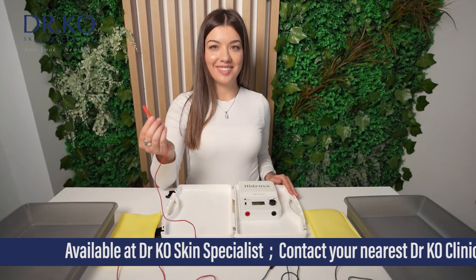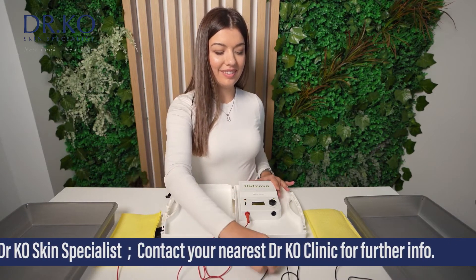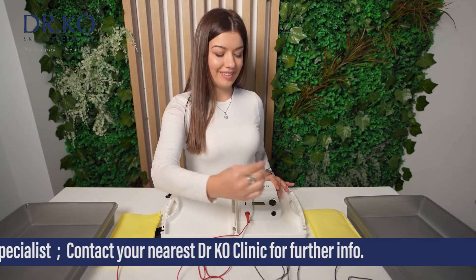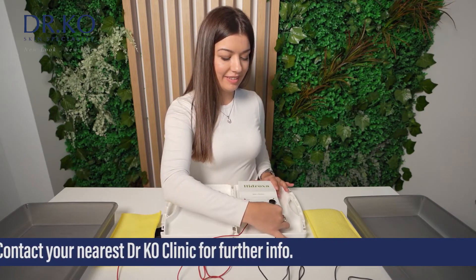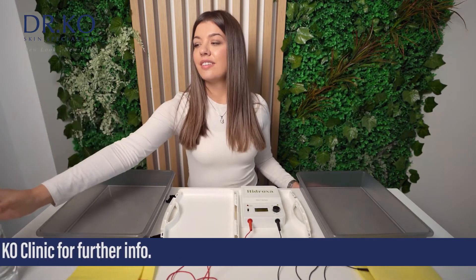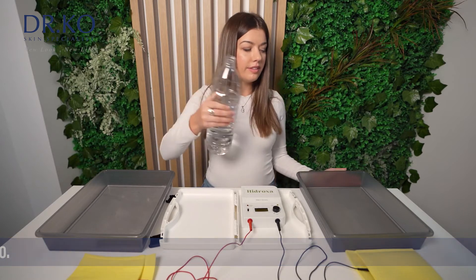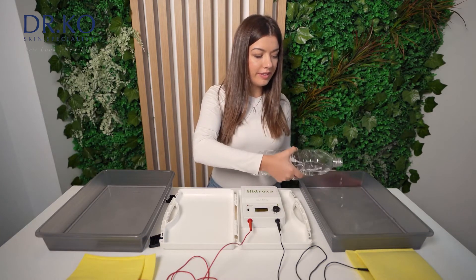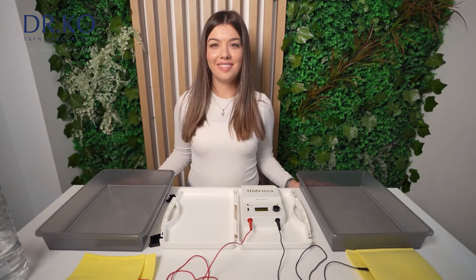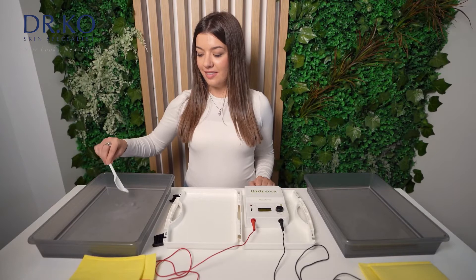Let's start. Please check that the electrode cables are connected to the electrodes and to the machine. Make sure the charger is not connected to the machine. After this, pour water into the plastic containers. Make sure that the water covers the area you wish to treat and no more than that. Add a teaspoon of salt into the water in each container.